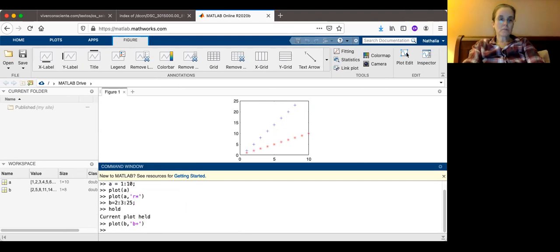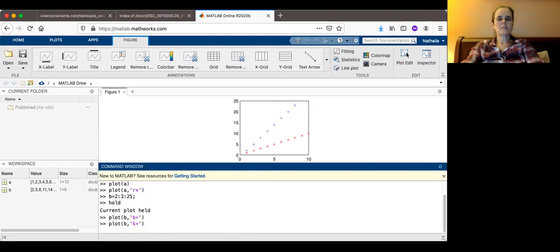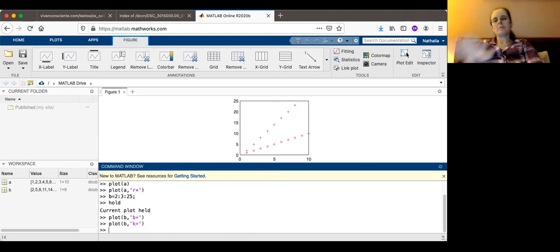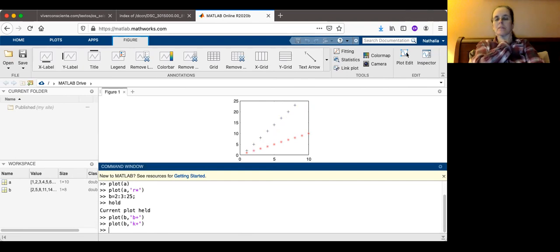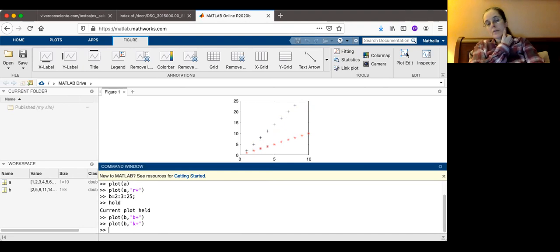I'm going to plot B as black pluses. Let me see if I know how to plot. Black's probably K. Let's take a look. So now you see my B plotting on top of A. This is the basics of what we're going to do for homework three.